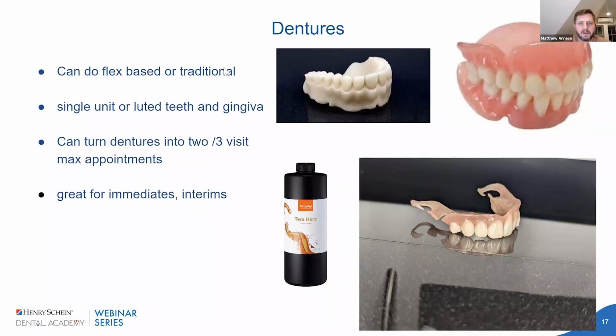Dentures, we're starting to get more into this, not because I'm doing dentures. I personally don't do any removables in my office. There are no overdentures. We got rid of overdentures. We got rid of dentures completely. But there are a lot of times where I have people who have been denture-less come in with no teeth, and I'm like, okay, well, for me to do this hybrid or to get you something, I need a reference plane, I need to set up 8 and 9, I need the VDO, I need this. So we'll do a scan and we'll just make something up real quick.